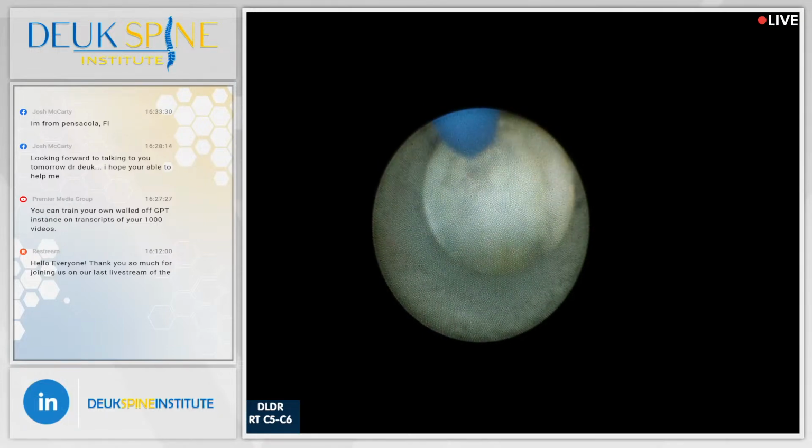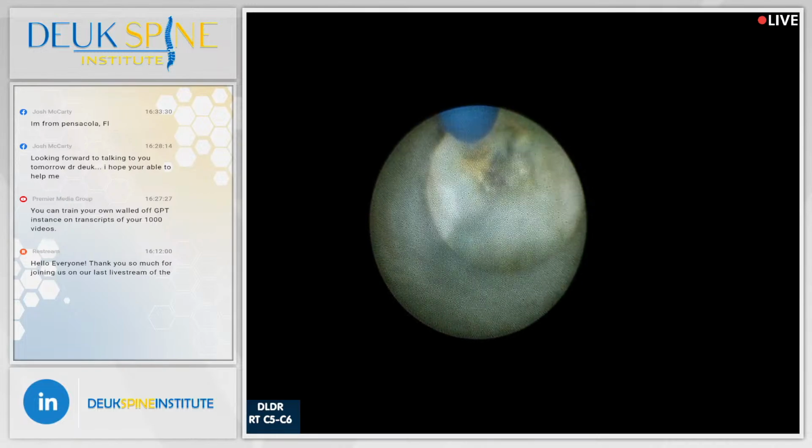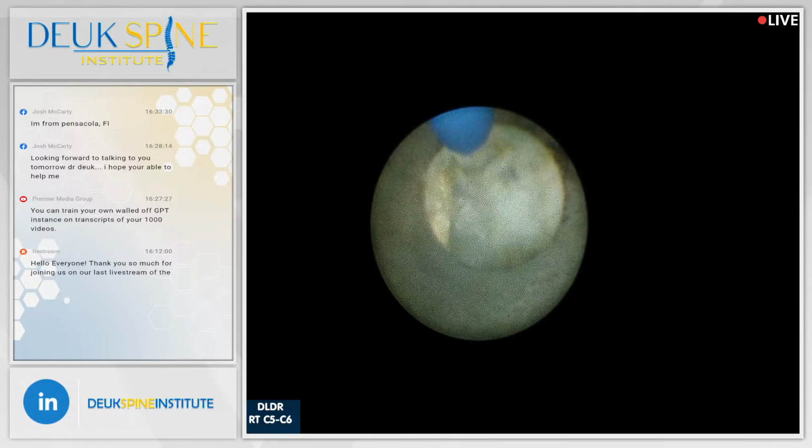I think I was telling you earlier about the luminous laser that we're using from Israel. Wonderful. It's the best laser there is. It's a holmium YAG used by many different kinds of doctors in medicine, from urologist to OB-GYN, and of course to neurosurgeon.